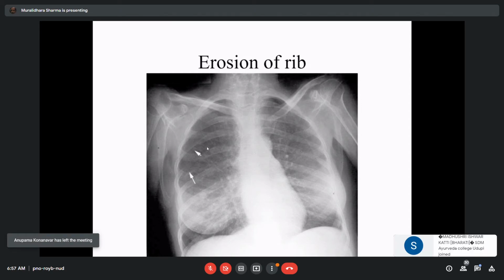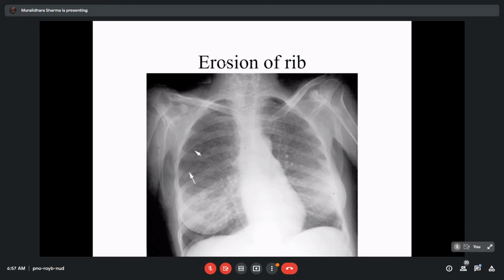So third, fourth rib shows an area of erosion where the segment has become narrowed. So this is erosion without much inflammatory activity. More detail on inflammatory activity and the causes of erosion we will discuss later. Now this is just an exercise to condition your eyes to look at the abnormalities immediately. So these are all conditioning factors, which you have to make out.